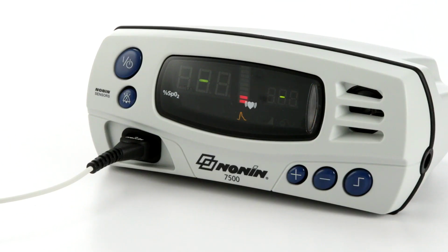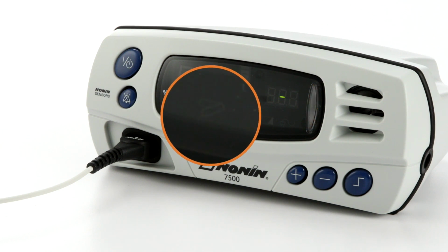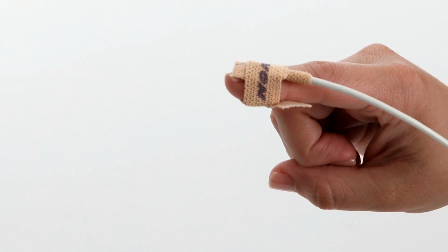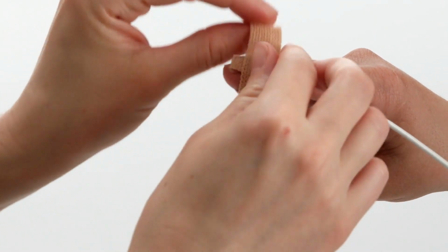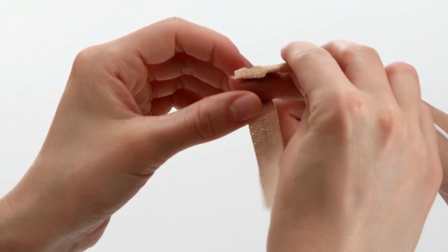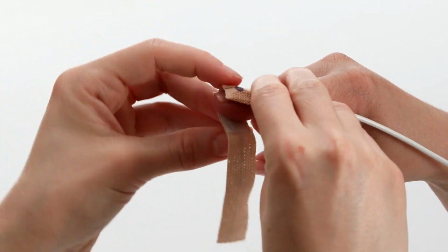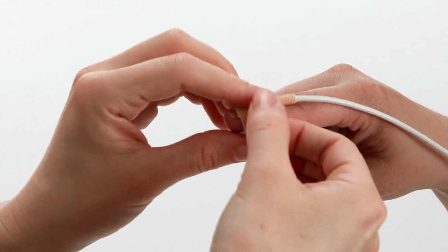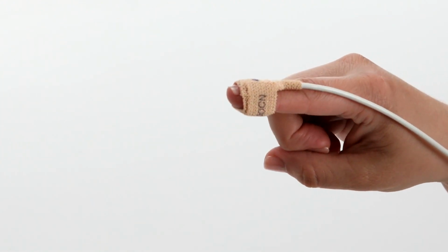A sensor icon will appear on the screen and the oximeter will alarm if this occurs. Signal can also be reduced by body position or cold conditions, which may reduce blood flow. Check and correct the position of the sensor if it has moved, and recheck the sensor connection to the oximeter. Hybrid averaging mode will take these short desaturations into account, reducing the potential of false alarms.